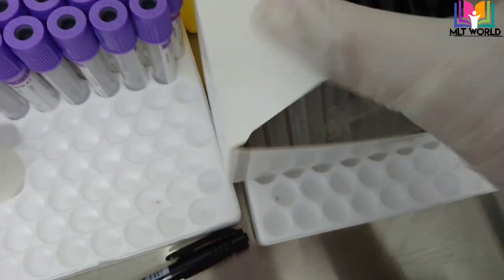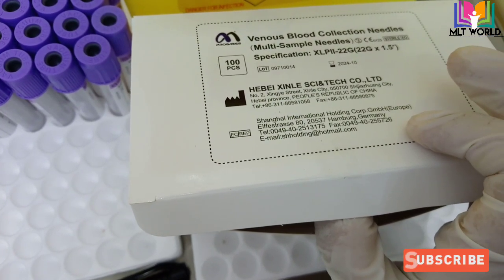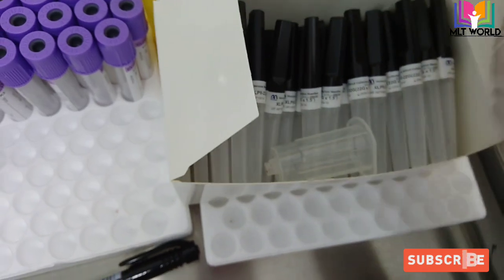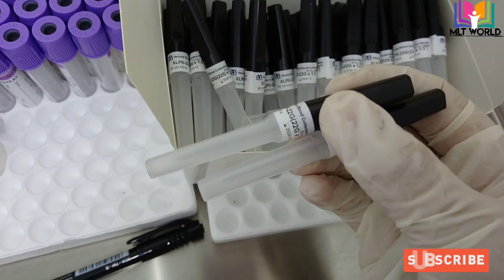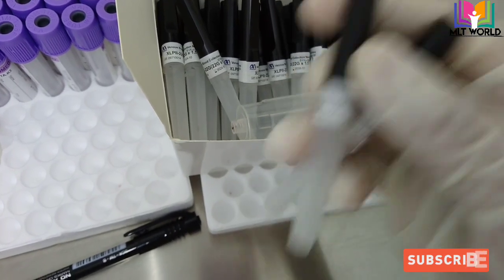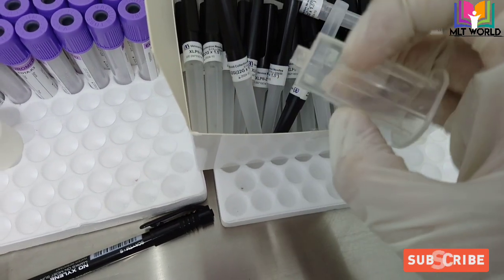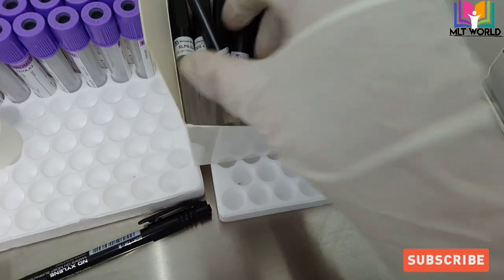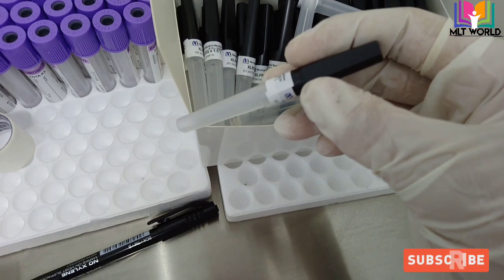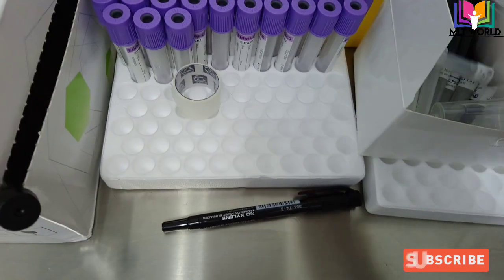Welcome back friends. Today in this video I will show you how to use a vacutainer needle for venous blood collection for multi samples. There are two types of vacutainer needle covers: black and green. The difference is in the needle. The black one I am showing you is 22 gauge, and the other one I showed you is the holder.